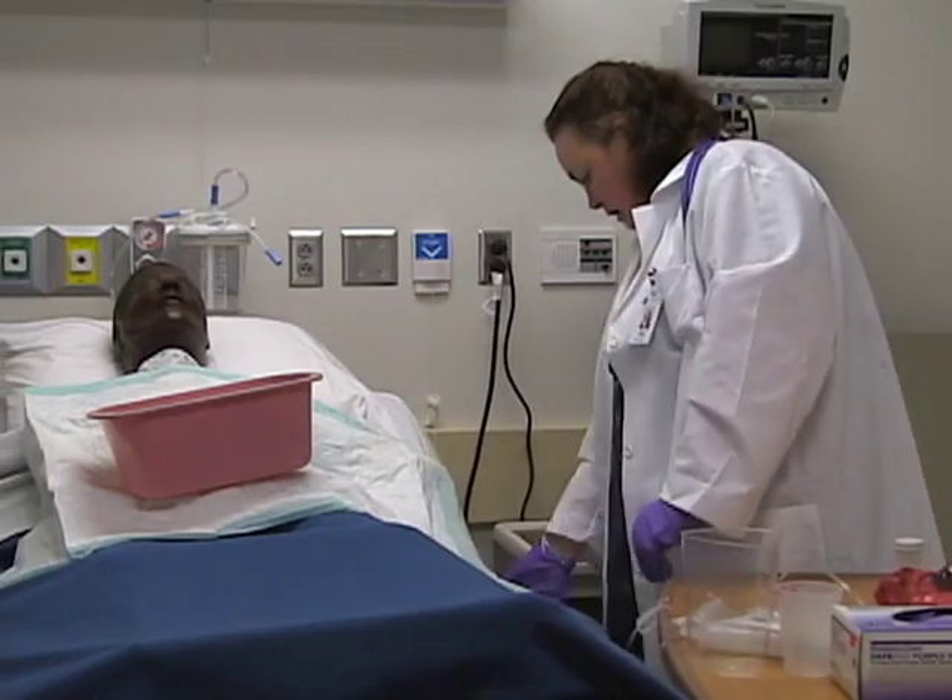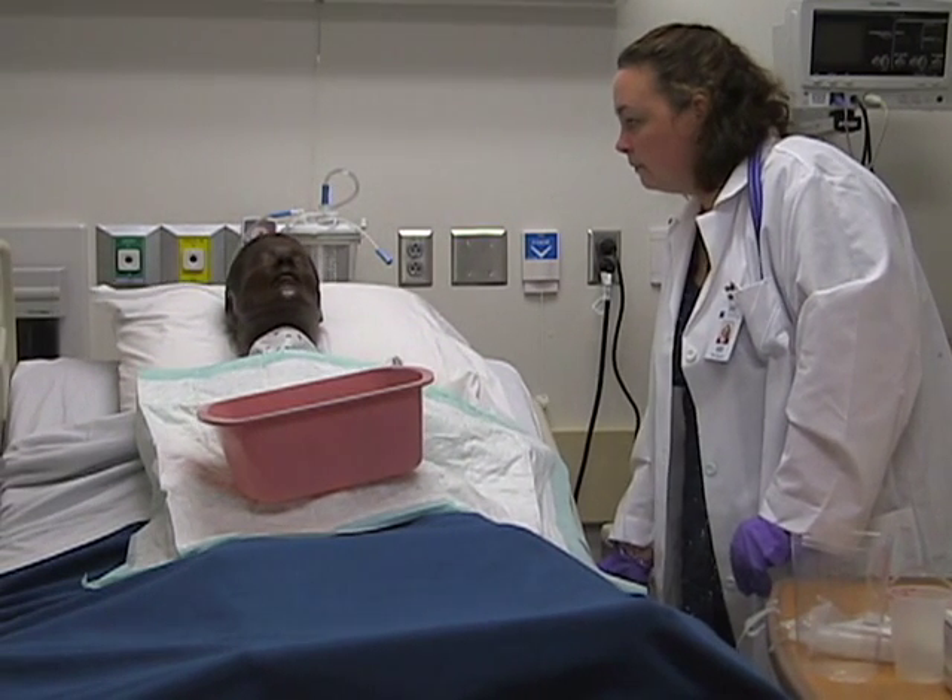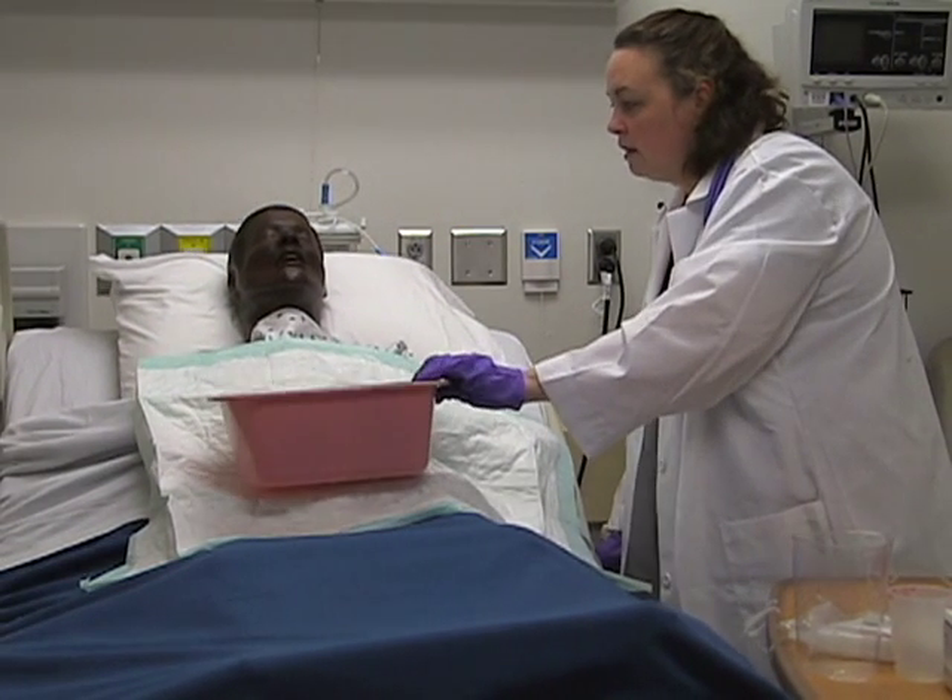You may also want to increase the head of the bed so the patient is sitting up a little more, so they're not quite so reclined during the procedure.